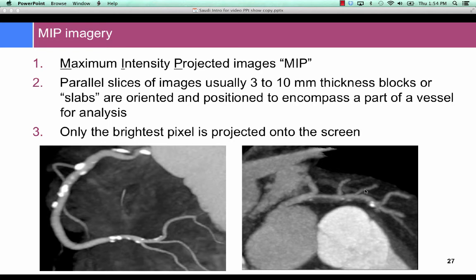On the lower right column, on the other hand, we have a large vessel. I don't know the orientation. I'm not sure which vessel this is actually, but you see contrasting elements now. And in the wall, we have large soft tissue encroachment on the lumen. This vessel is swollen. There's very low Hounsfield density components. There's spotty calcification in a long segmental segment of this vessel. And this would be a very highly concerning plaque to have in your patient, and one that would really prompt aggressive investigation and aggressive therapy that might even include the placement of a stent or bypass surgery.